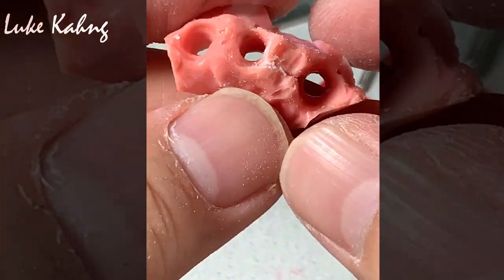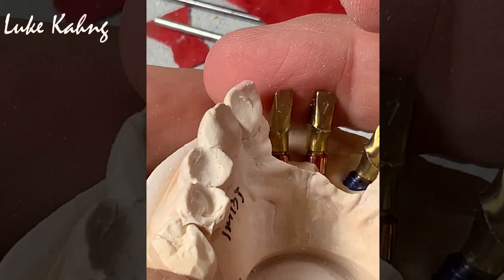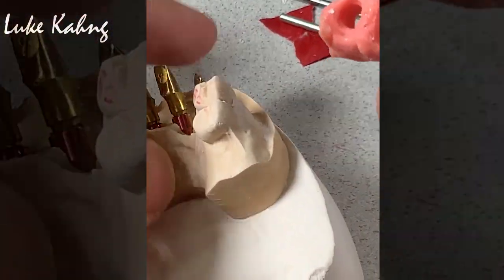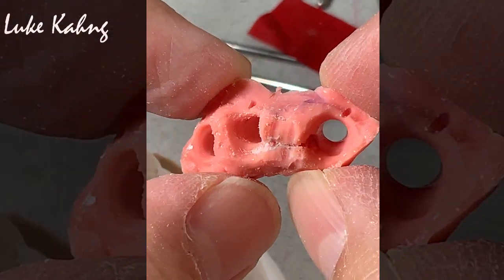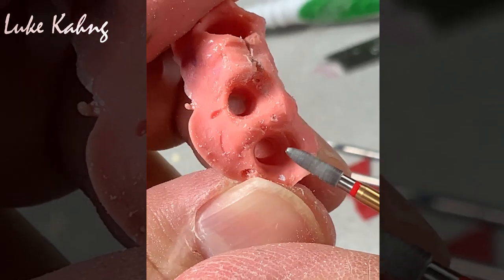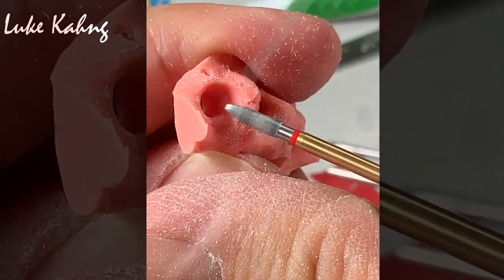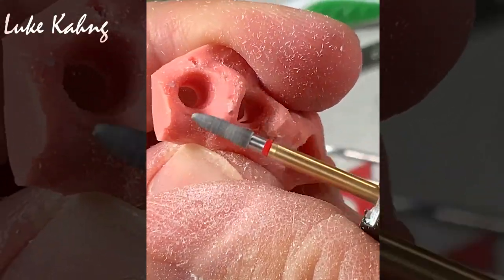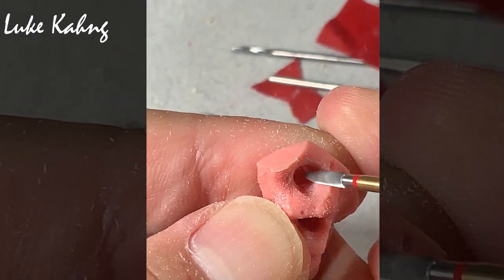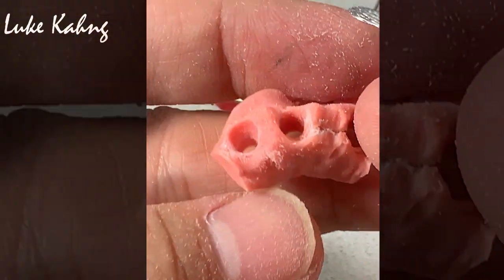Alright, so I would like to explain to you regarding 3 implants, which is temporary implants, just like this. Fabricate the new custom abutment. But this tissue is really tight and high. So what we did, we're trying to cut it a little bit and make it smooth. And then the better contour, otherwise for my restoration, we don't have any room for the final contour. So that's why we made the temporary, right?